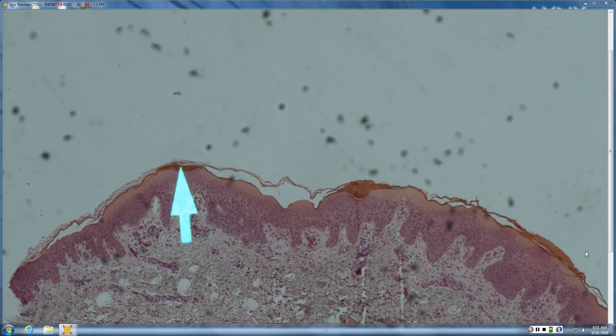And so then what you hope to see, microscopically in a textbook case, is at roughly a 45-degree angle, very roughly, you see some spongiosis, which you can see here. It's kind of right underneath it. But let's just imagine it's kind of 45 degrees. And then 45 degrees from that, you see a focus of a predominantly lymphocytic infiltrate, likely viral mediated.